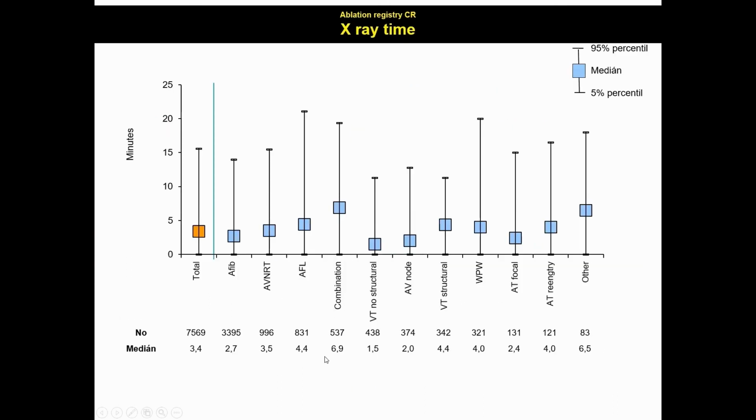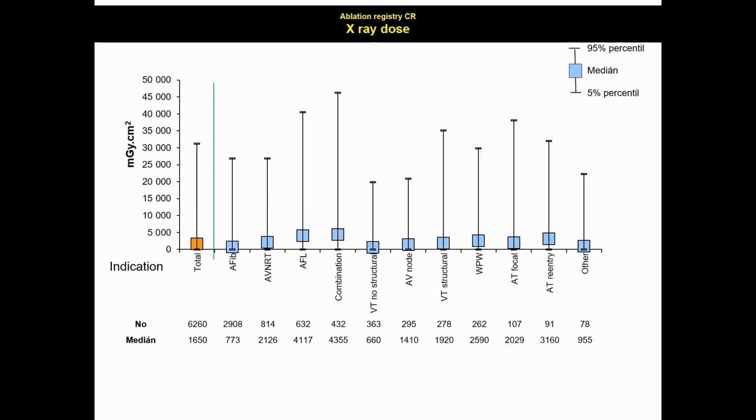X-ray time has also decreased very much since the beginning of the procedures. It's around 3 to 6 minutes, but there is great variation. More important than X-ray time in minutes is X-ray dose. It's also very low if we are using a 3D mapping system and ICE, but again there is great variation in this X-ray dose.